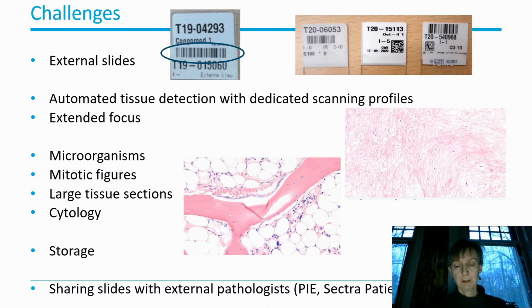But another area we didn't expect was the large tissue sections. If you are used under the microscope to scan them very fast, if you have a large resection, it proves to be much more time consuming to do the same on a digital slide, because you have to zoom in further to see the same details. So that's still work in progress to see how to improve this.